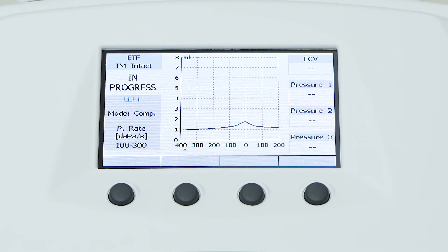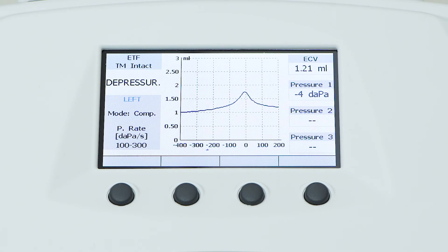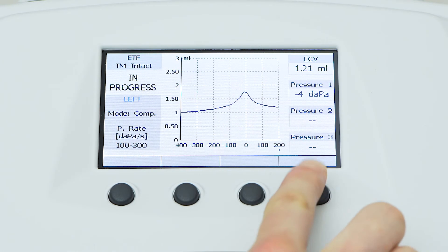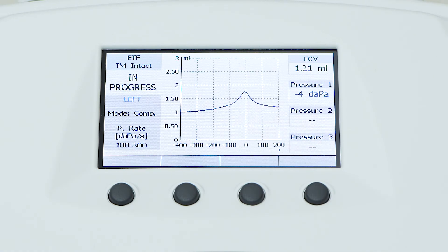After the completion of the first tympanometry test, the patient is asked to swallow several times, thereby forcing the opening of the Eustachian tube. Once the patient has complied with the instructions, simply press the continuous function button to start recording the second tympanogram.